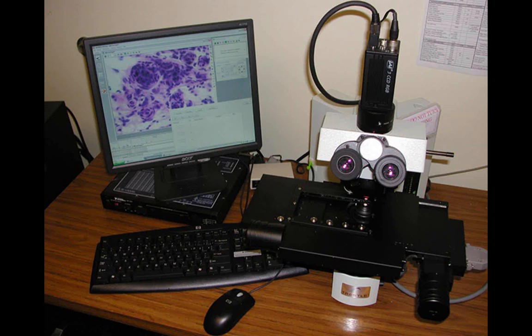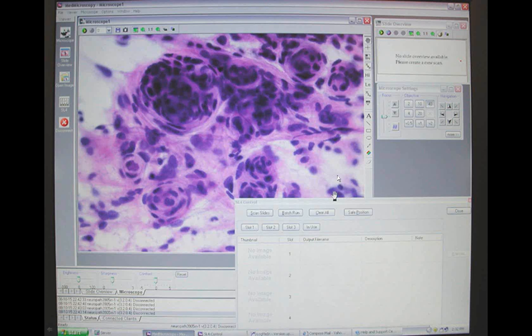And the way we're doing it is through these robotic systems here, where the technician who's on site prepares the slides and loads them in these little chambers here on a motorized stage. This is a microscope with a very special motorized stage and a camera that can be controlled by remotes. So here, for example, would be a website.